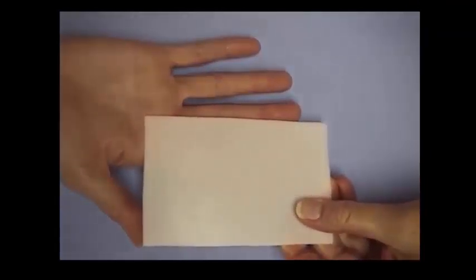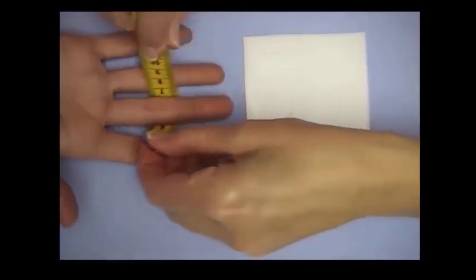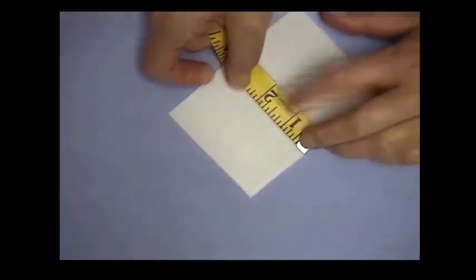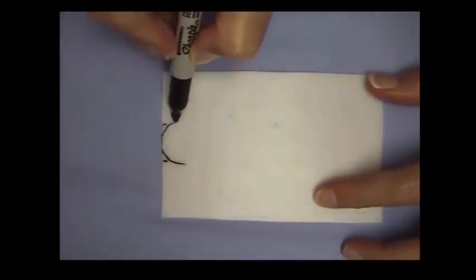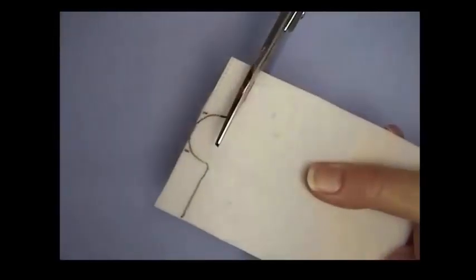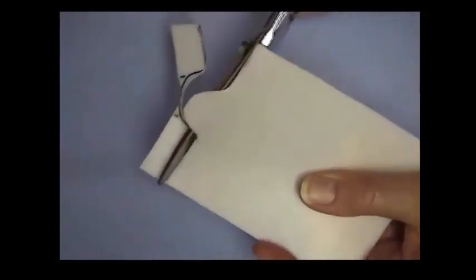Here we take a scrap of thermoplastic material that is as long as from the distal palmar crease to a bit distal to the tip of the finger. We also want to assure that the scrap of material is wide enough — you can measure the finger, here we see it is 2½ inches, and you would like at least an additional inch beyond that width. I now mark the width of the finger on the cut square piece, which is the same shape as described in the pattern. We're marking the depth of the piece that we want over the proximal aspect of the proximal phalanx. When cutting this out cold with 1/16th inch material, it's important to keep rounded corners.